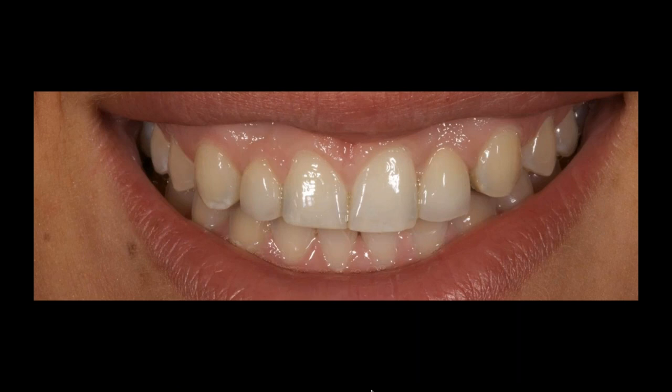And we've learned that over a period of time, the reason Maryland bridges debond or de-cement is really because you're putting them on two teeth. The two teeth are in ligaments that move, and they help ease the cement or the bonding material to break away. So I know it might sound crazy to some of you, but we've been doing one wings for 4 or 5 years now. You don't need more than that for a Maryland bridge.